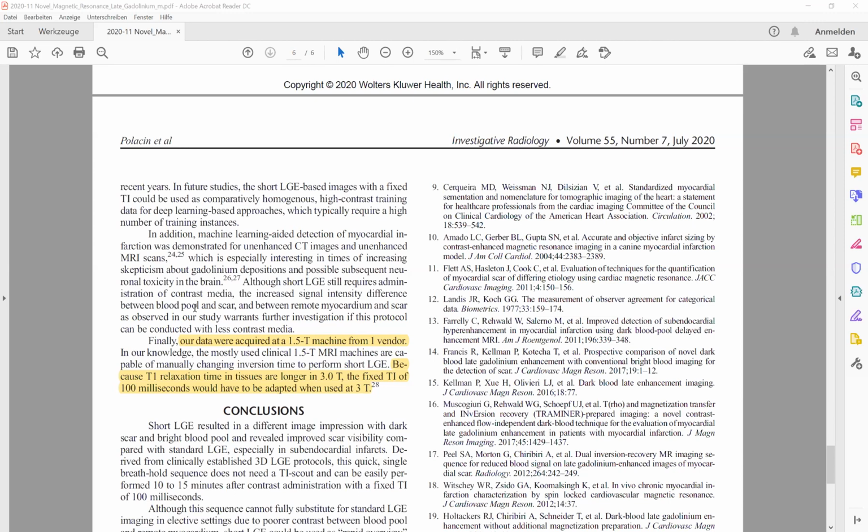Okay, so further studies are needed. Yes, like every time. Okay, the next question is, I wonder how an amyloidosis type enhancement looks like using this short TI method, and if it would be beneficial to use an inversion time otherwise used for short tau IR fat suppression.